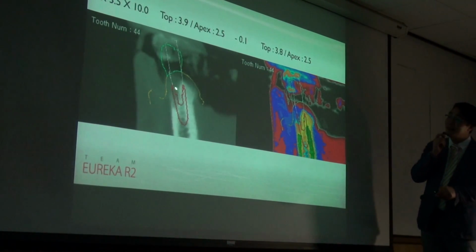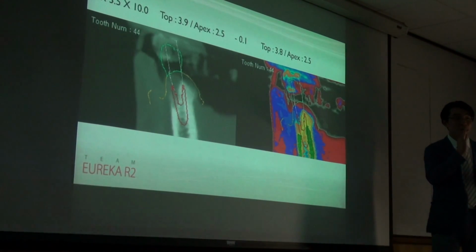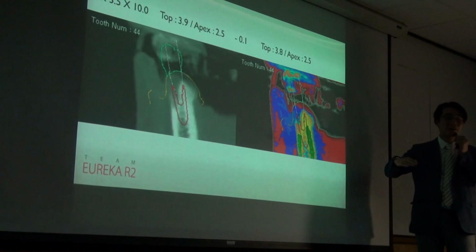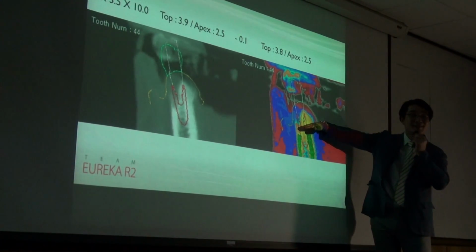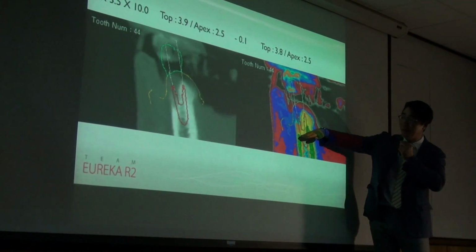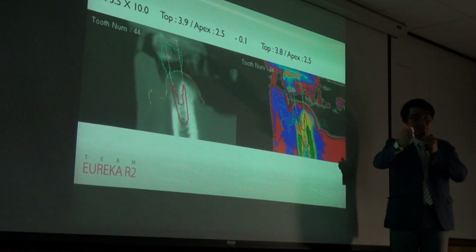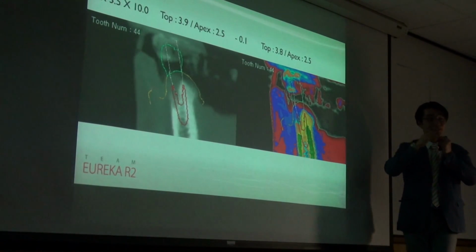But the implant shape is a taper shape. So like an endodontic treatment, I make the drill step backs. Using a straight drill, if I make a step-back sequence, I make a tapered bone preparation. Can you understand me? Yeah.